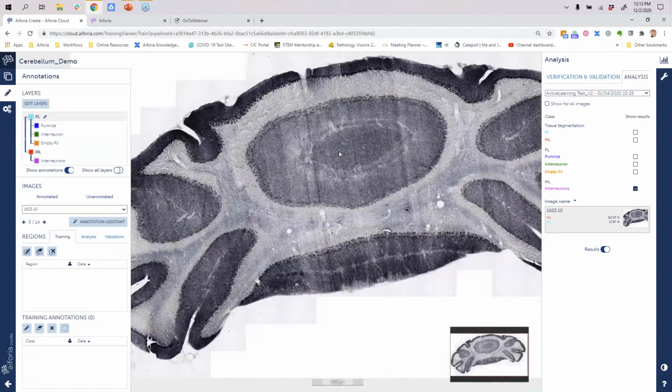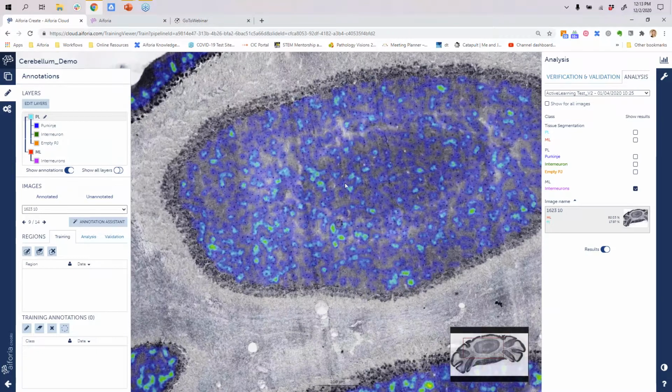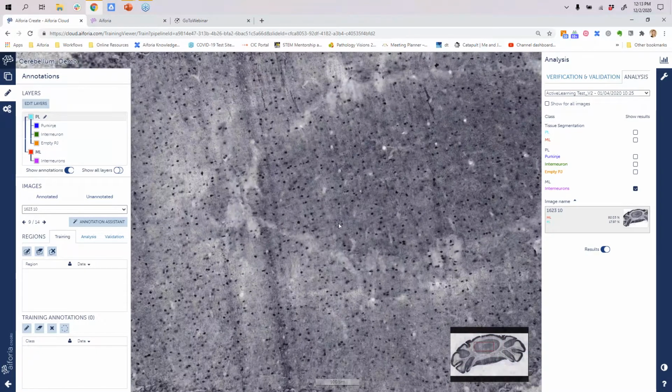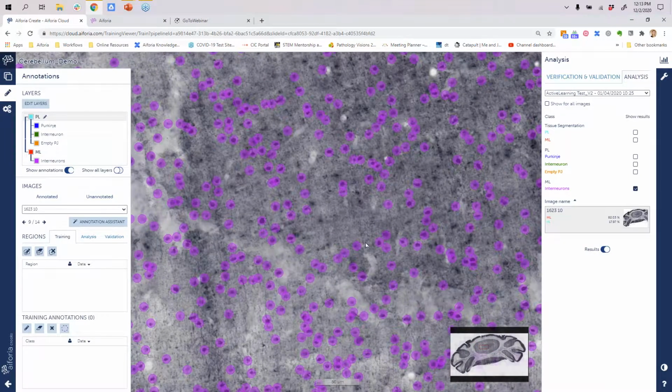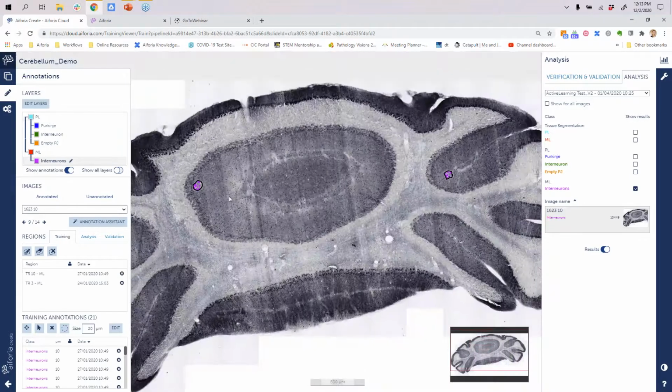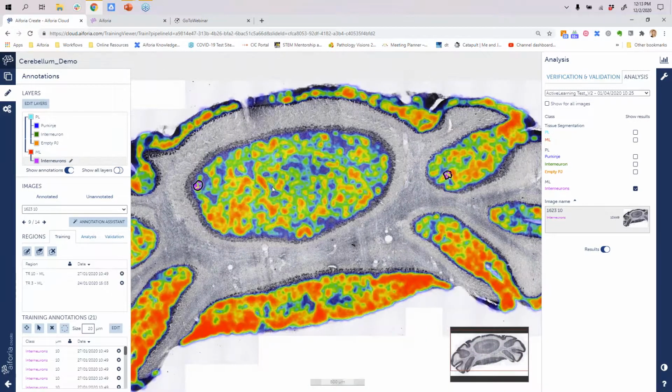So let's just review one of those tools that we saw earlier. That is our converter tool. I think I only have just a couple of annotations on this slide here and here, but let's say I know that I need more annotations.